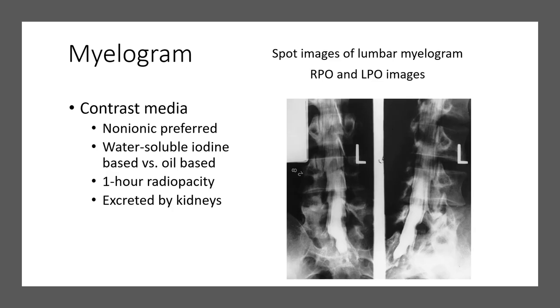Myelogram contrast media should be non-ionic, preferably water-soluble, iodine-based versus the oil-based. We no longer really use the oil-based, even though that was the best kind during a myelogram. There's less chance of reaction and issues if you use the water-soluble iodine-based. One hour max of radiopacity for the best possible images. It's excreted by the kidneys, and here's a nice example of RPO and LPO images.